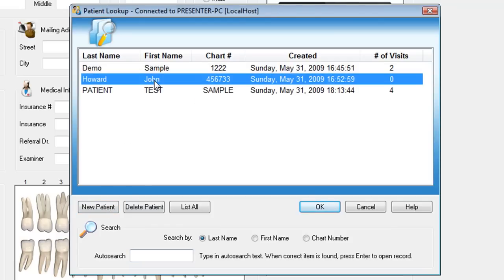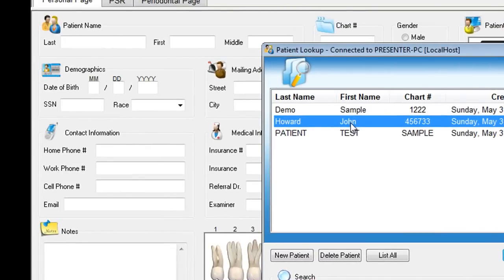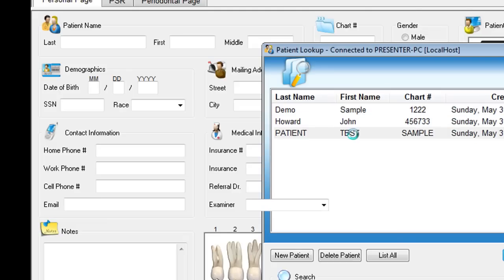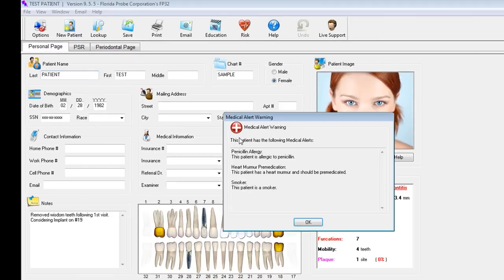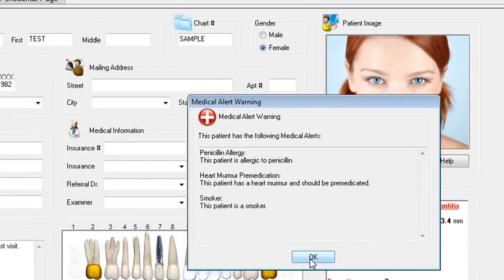You can see here that John was entered earlier today because he'll be coming in later and has no visits now, but it allows us to go ahead and mark personal information as well as missing teeth to save time. The test patient we'll be looking at next has four visits and has come in today. It pops up a medical alert warning — this particular patient has an allergic reaction to penicillin, needs to be premedicated due to a heart murmur, and is a smoker.